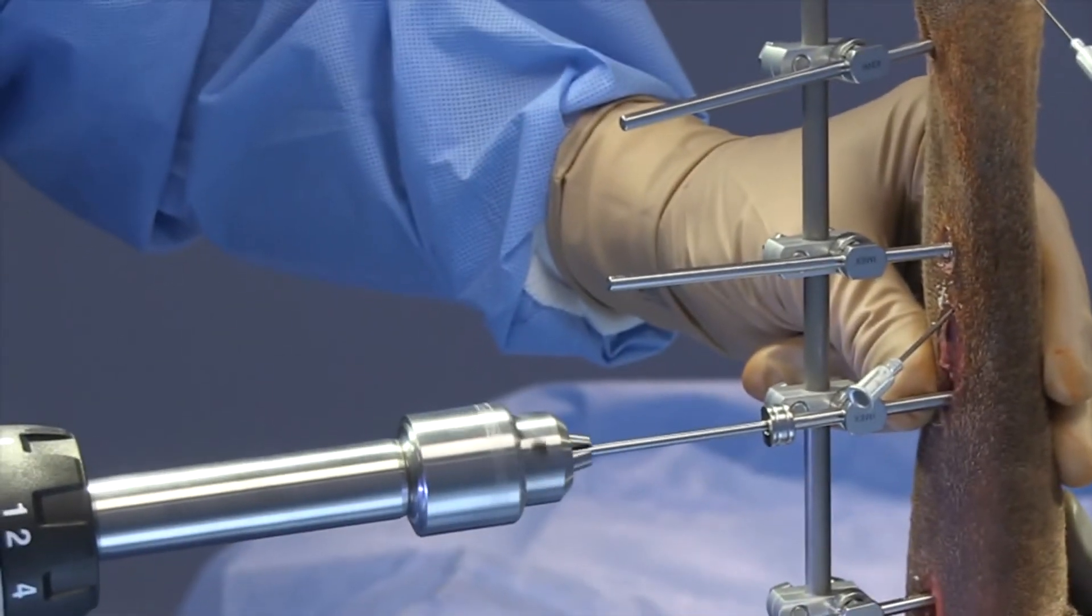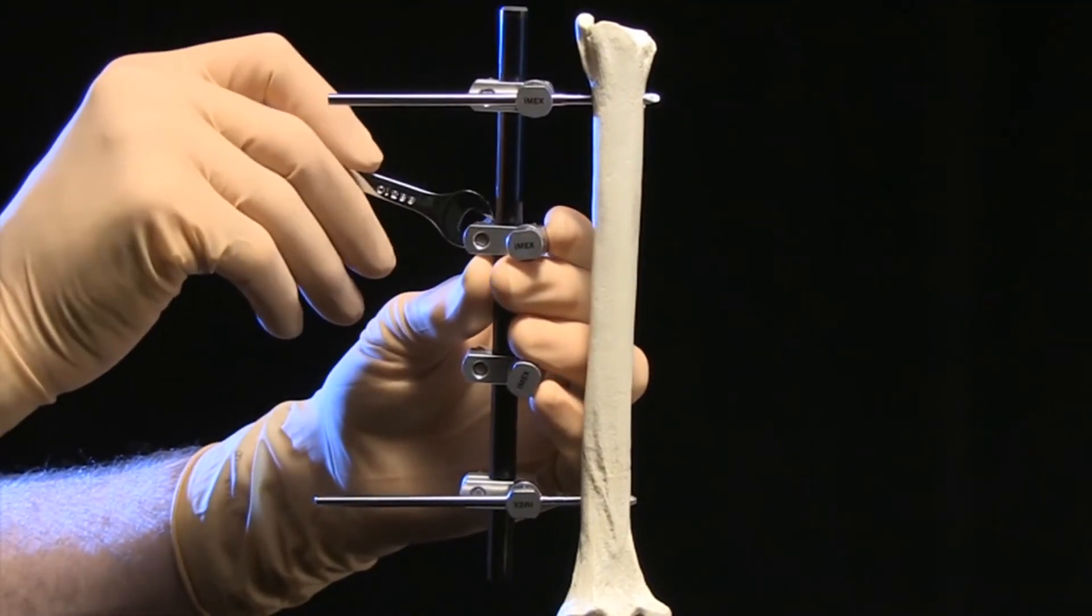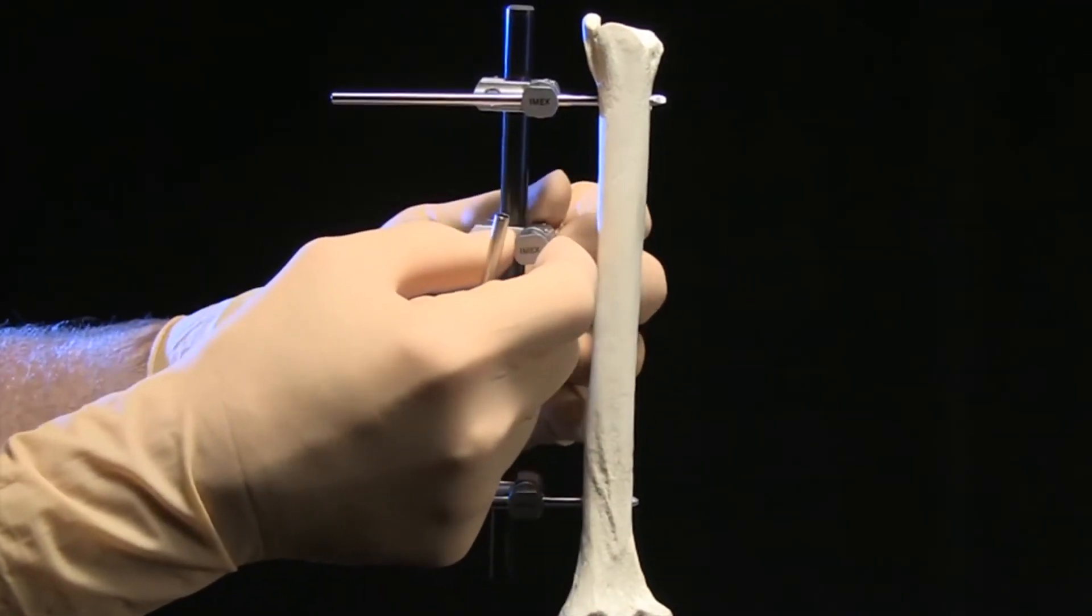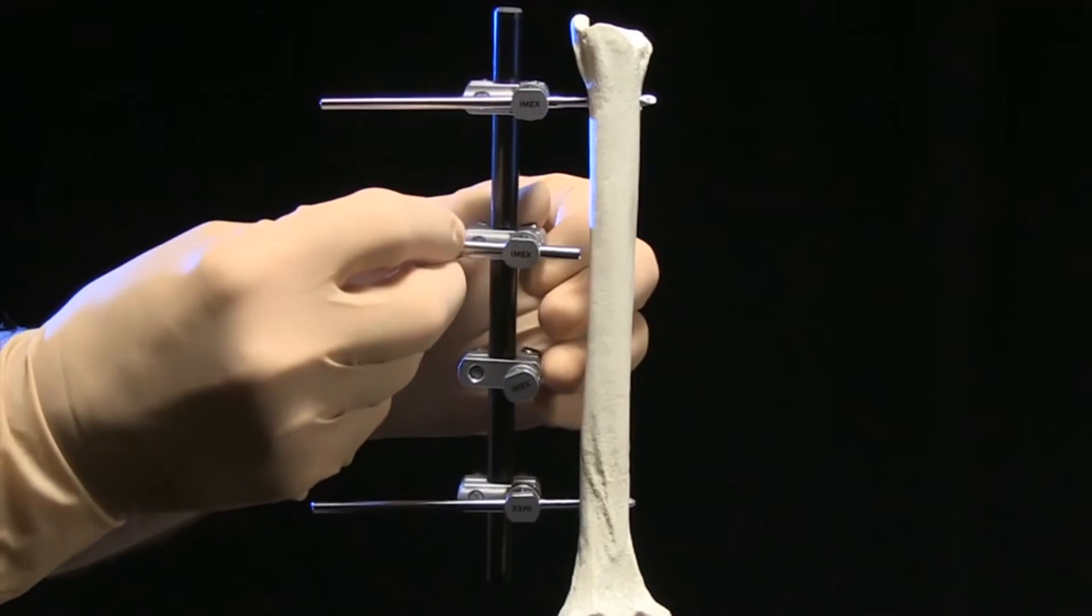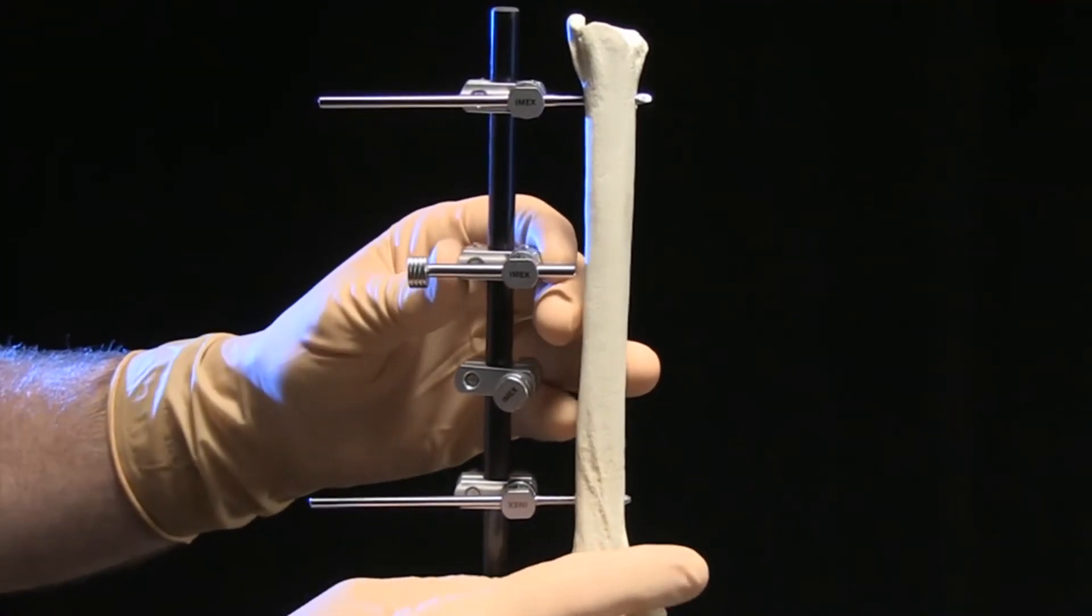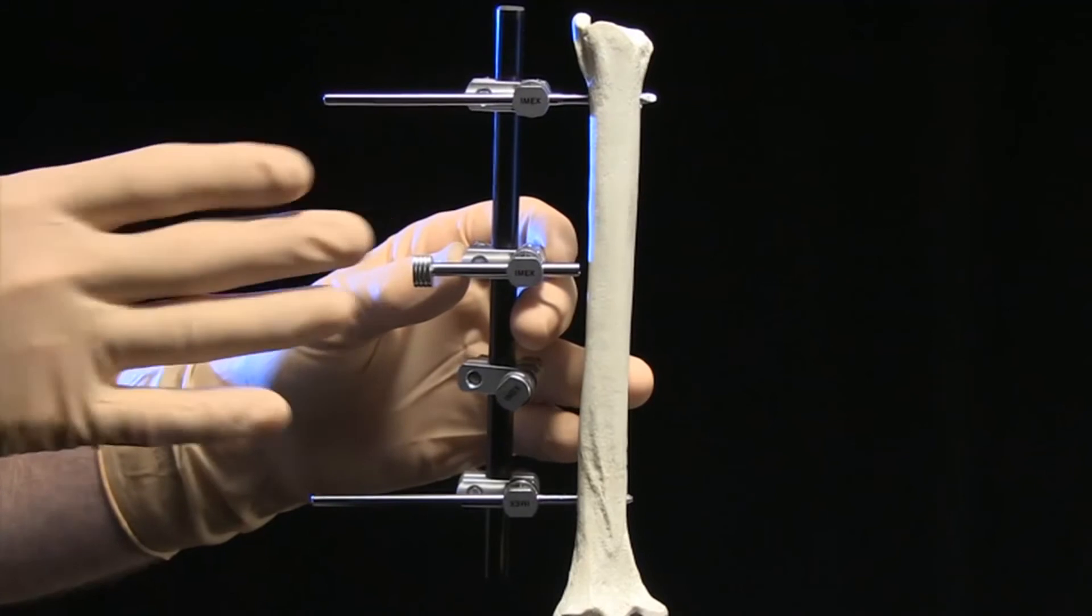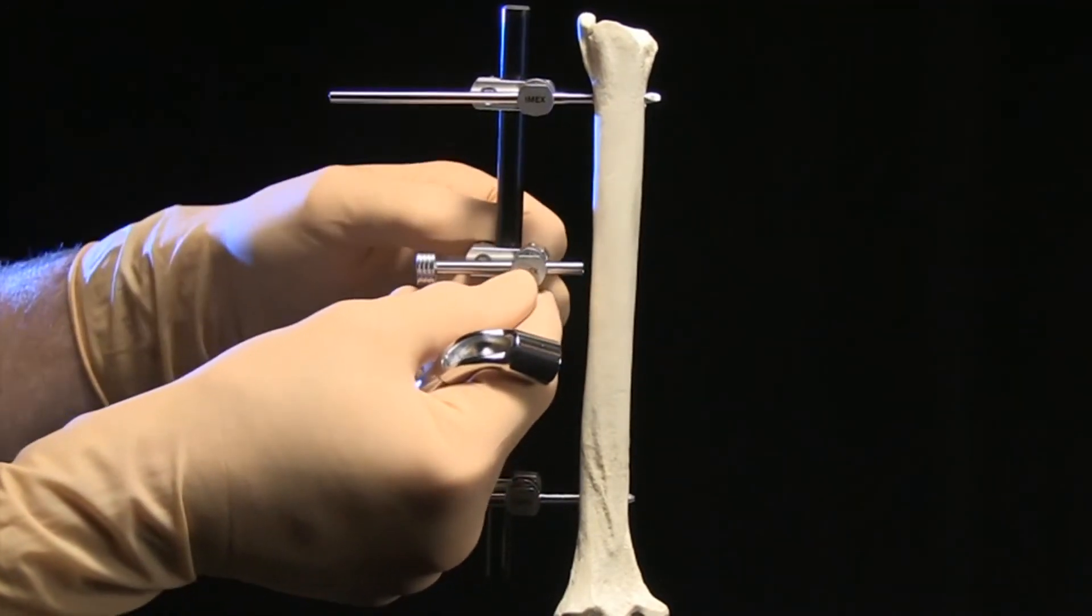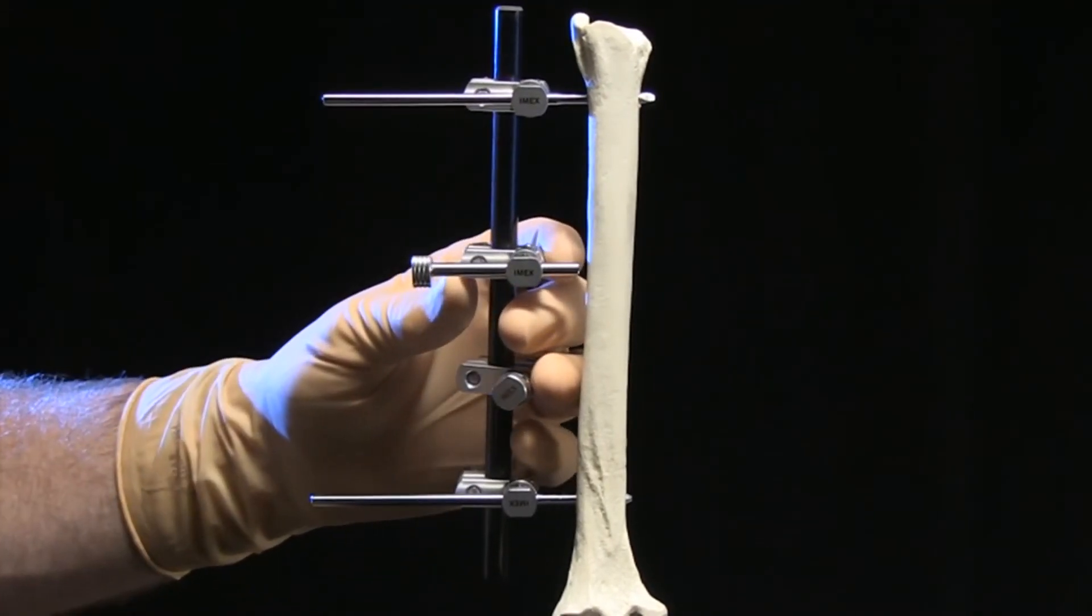Pin placement through a pre-placed clamp is performed as follows. First, using an empty SK clamp on the partially constructed frame, the clamp is placed at the approximate position desired. The appropriately sized drill sleeve or drill bit is then placed through the primary bolt. Next, the position of the clamp is fine-tuned proximal and distal along the rod and then rotated around the rod to the desired position for pre-drilling. When the drill sleeve is properly aimed, the secondary bolt is tightened an additional amount to maintain the clamp and sleeve in this position during the pre-drilling process, as well as during the pin placement process.